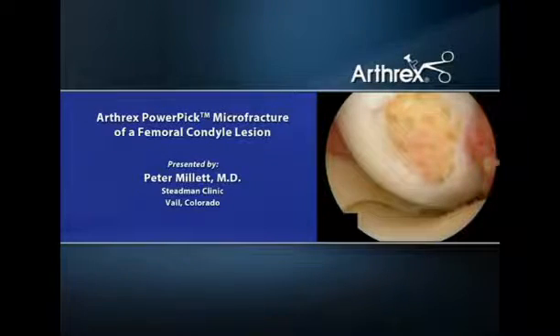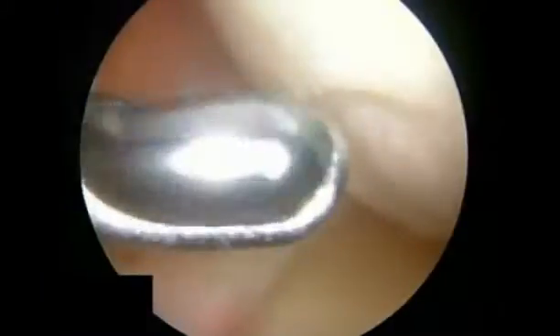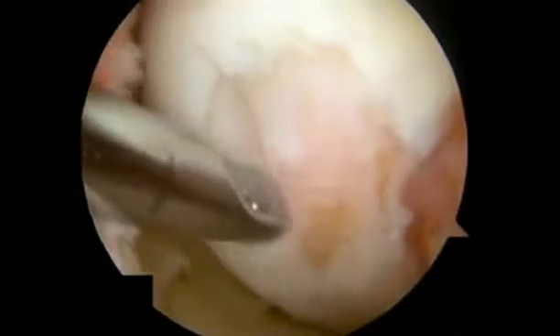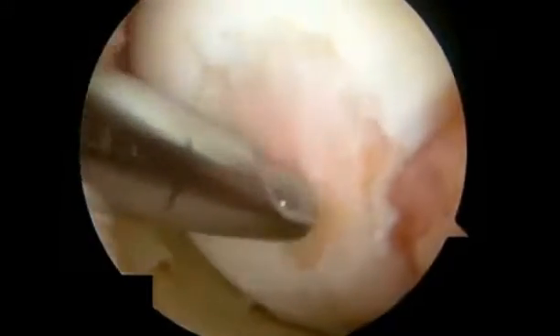This is a case example of a chondral defect of the medial femoral condyle. After visually assessing the defect, the surgeon should remove any unstable cartilage and expose the underlying bone surface. The calcified cartilage layer should be removed. This is confirmed by punctate bleeding at the defect base.